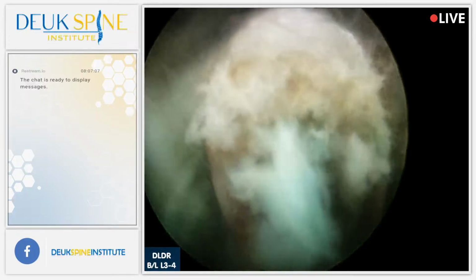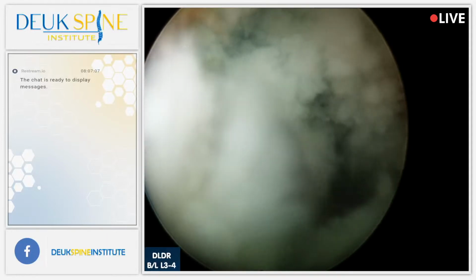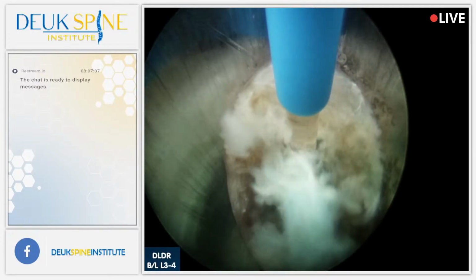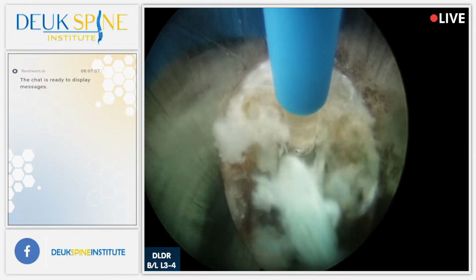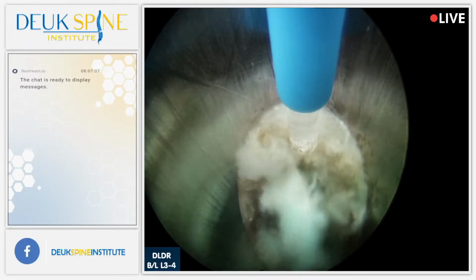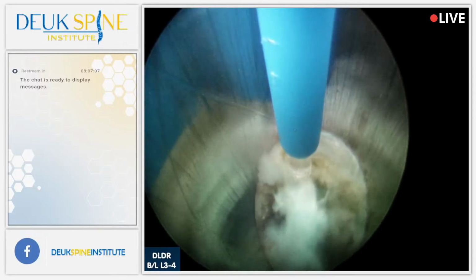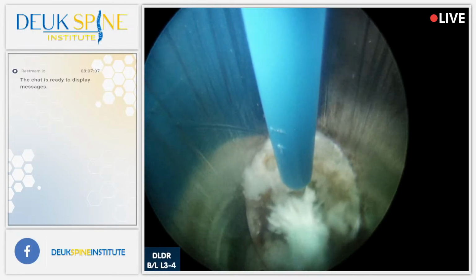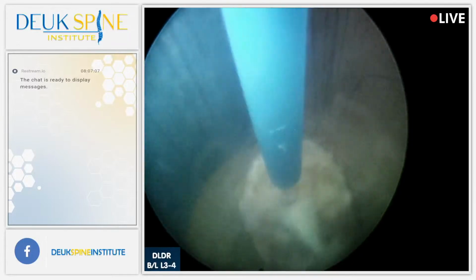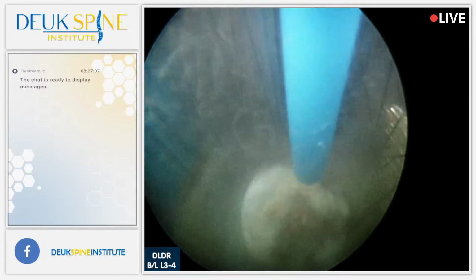So some people ask me, why, Dr. Duke, doesn't that laser get super hot and melt and burn? Here's the thing, guys. Out there on the internet is a lot of false information. Laser surgery that you're watching right now is so revolutionary and earth-shattering that all the other spine surgeons out there are very, very scared because they don't know how to do it and they don't have the resources to buy all the equipment and train the staff and learn how to do it. So they're out there bad-mouthing laser surgery, even though they've never done it themselves.